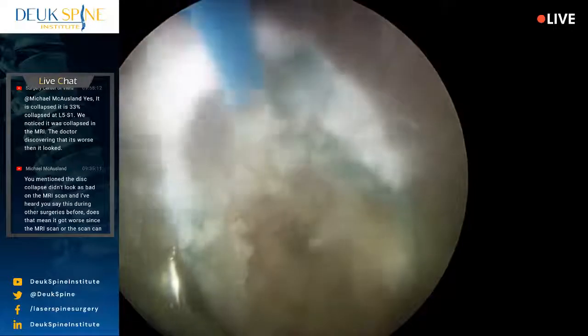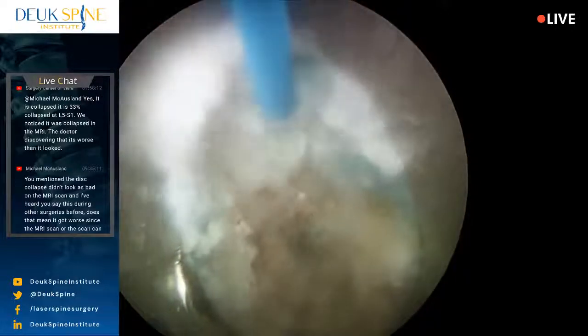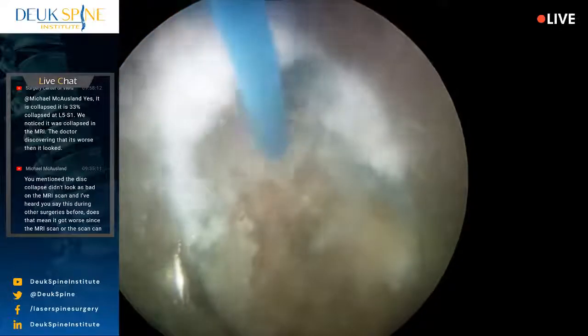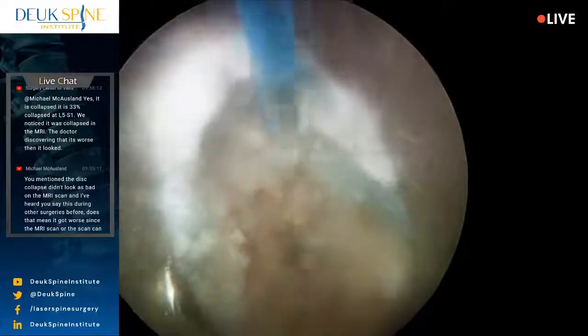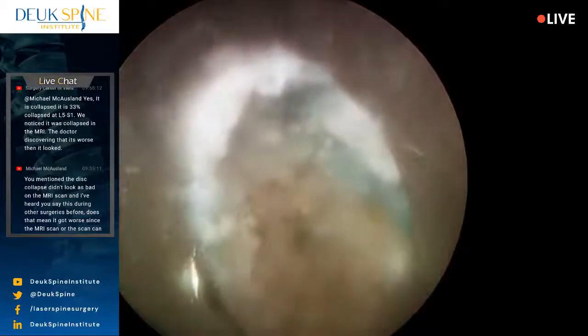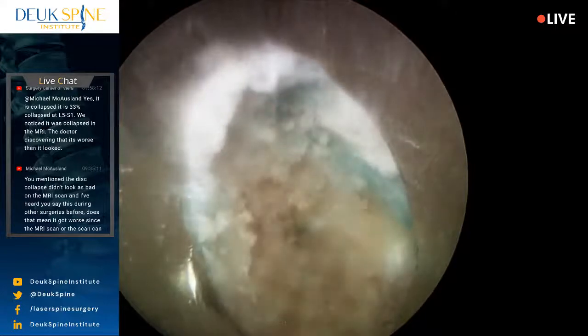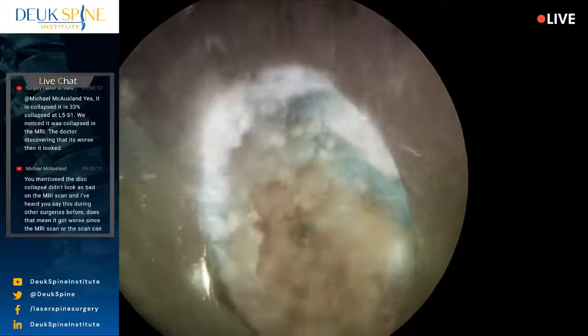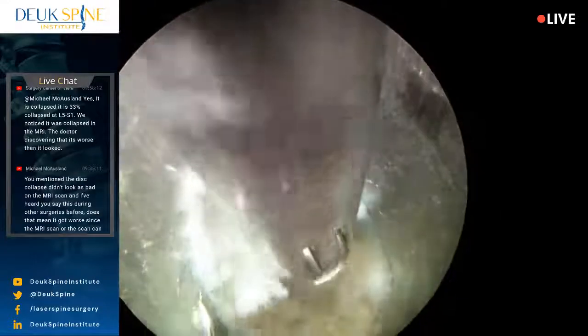So, long story short, L5-S1, the disc we're fixing right now, is almost impossible to get to. You saw it took me a little bit longer to get to than the L4-5. And the reason for that is it's the angle and the facet and the iliac crest, okay? It's a lot of things, and the disc is somewhat collapsed, so it makes it harder. And there's scoliosis, okay? So my point is this.